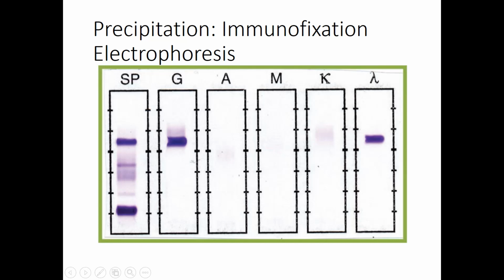And so we measure that against kind of the entire group of serum proteins, and we can see that they line right up. So we can see that the only reactions we really had with this patient was the patient had gamma chains, or IgG, that have a gamma heavy chain and a lambda light chain.